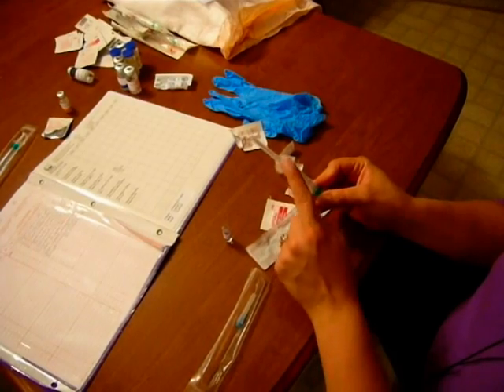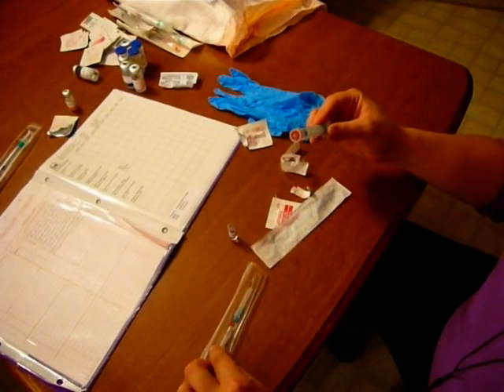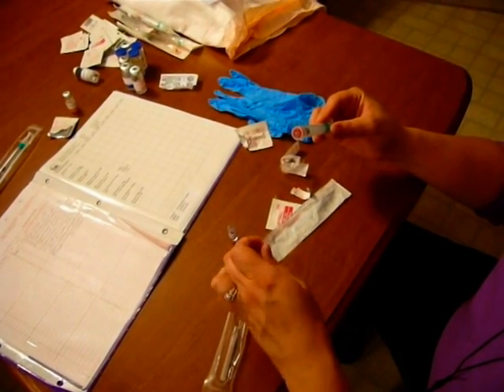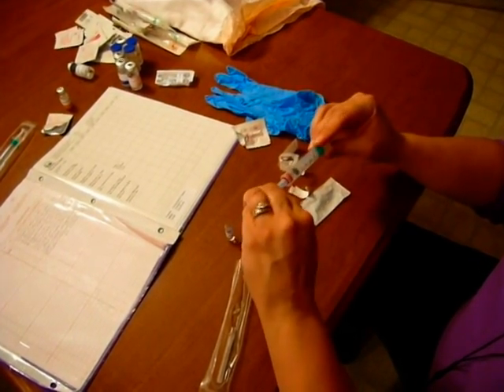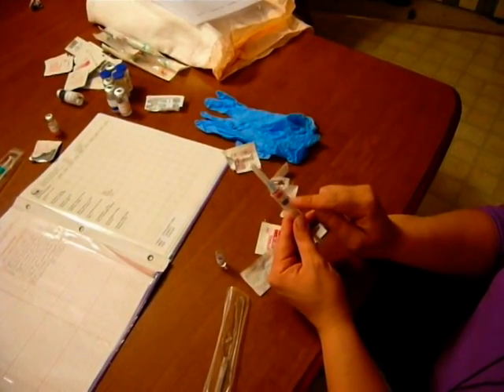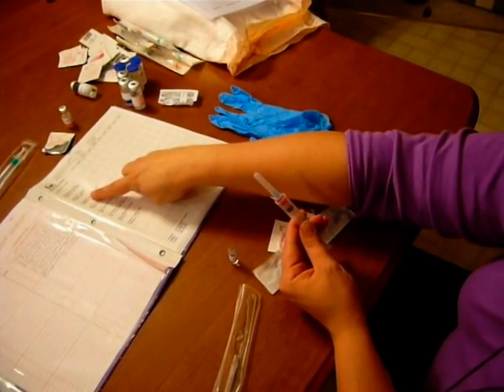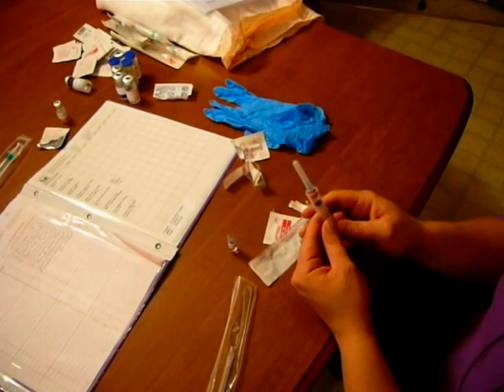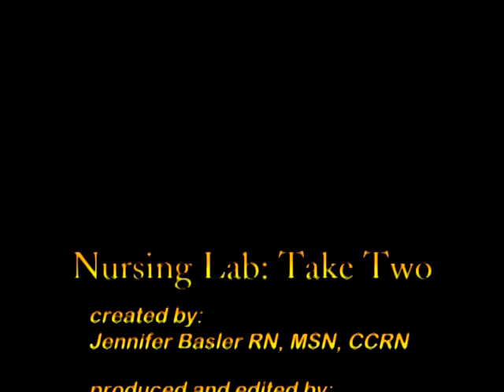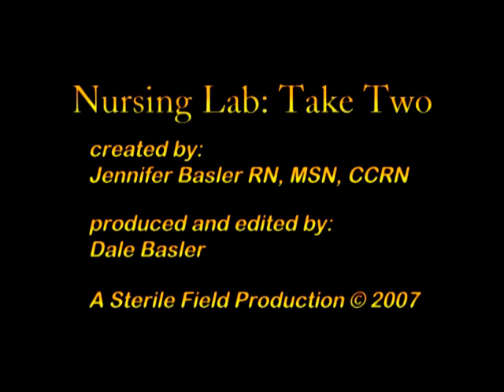Once I have the dose that I need, I need to change my filter needle back to my administration needle. I'll unscrew the filter needle and put it back in the sterile packaging in case I need it again, keeping the hub of the administration needle sterile. Then I put it on, and the last thing I do is confirm I still have 0.5 mLs, go back to my MAR, and verify that's what I drew up. I have that, and now I'm ready to administer the drug.